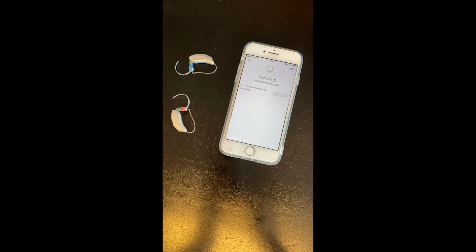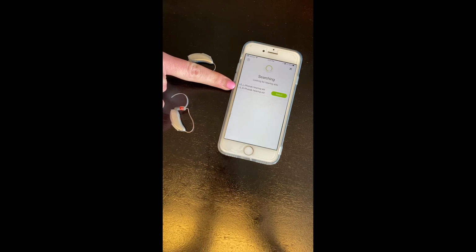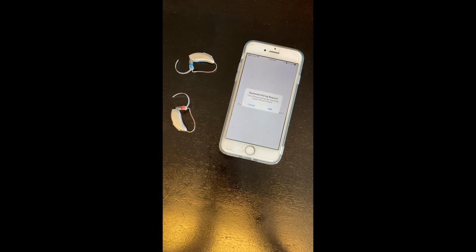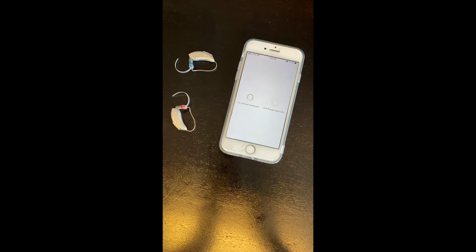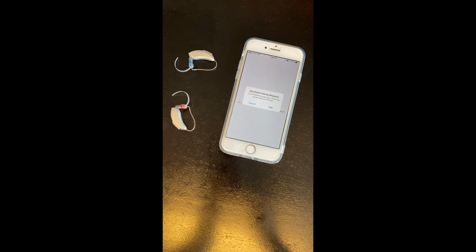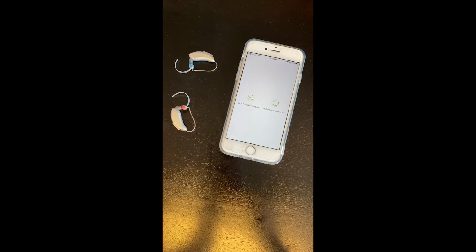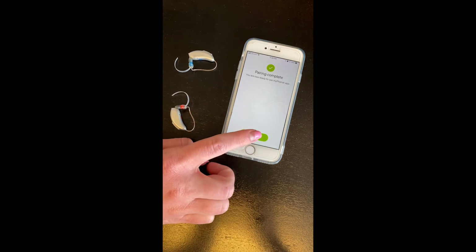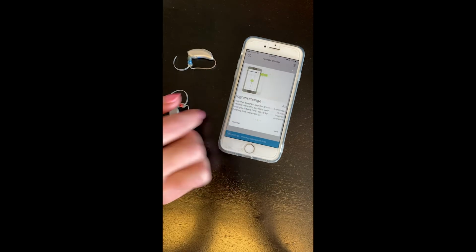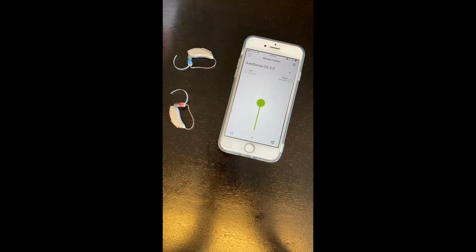Okay, it found one of them, but we want to wait until it finds both of them. So the LE left and LE right, Phonak hearing aid means that it's the app hearing aid. So we're going to press select. And then we want to press pair. Okay, and then we want to press pair again. All right, and we're going to press OK. All right, so again, you can learn the things that we're going to teach you today by swiping through there. We're going to press close though when we're done reading through those.